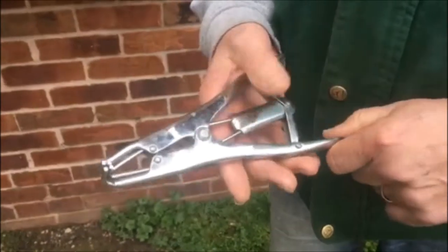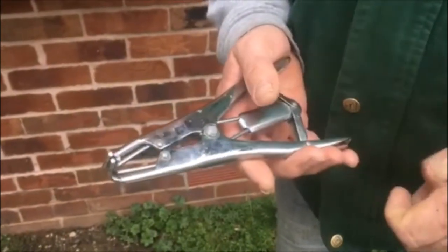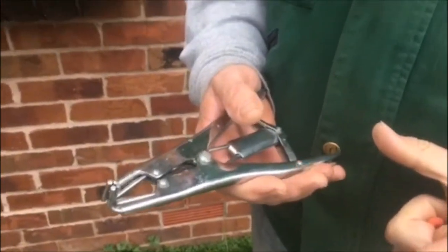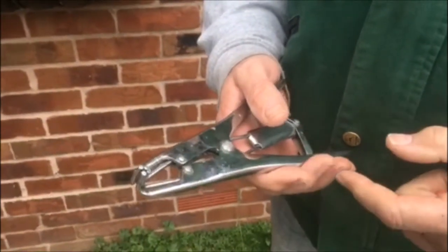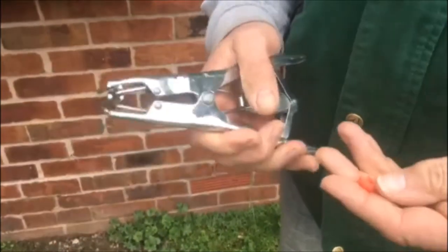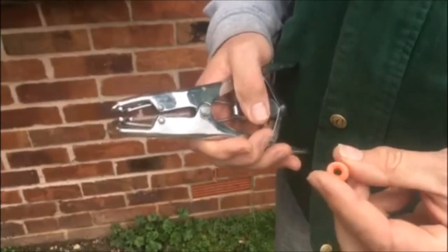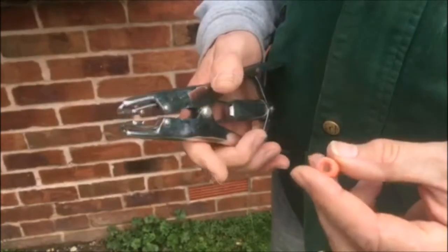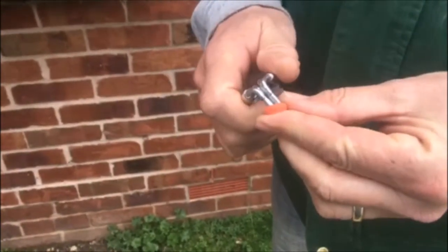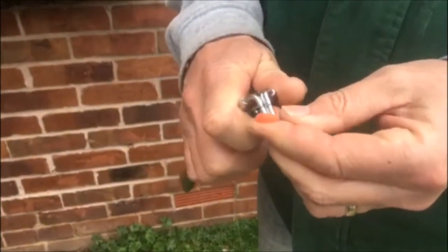We've got an implement which is very humane and I'm going to show you now. This is the implement we use — it looks a little bit more gruesome than what it actually is. It's like a pair of pliers but four-way. That's when it's closed, that's when it's open. And what we use is these little rings which are sterile, and as I say, it's a more humane way than actually cutting it or making a surgical incision.